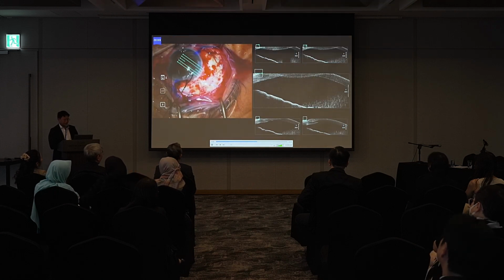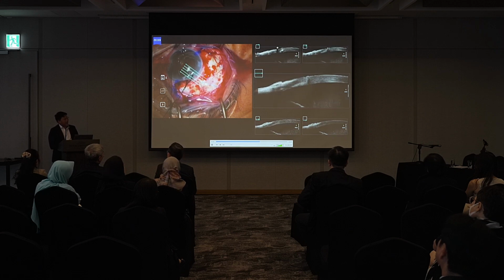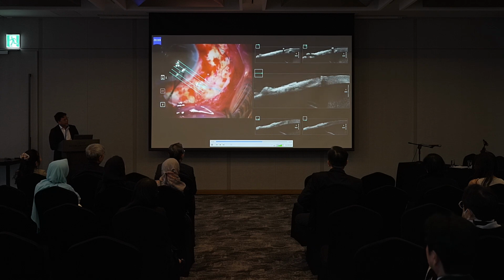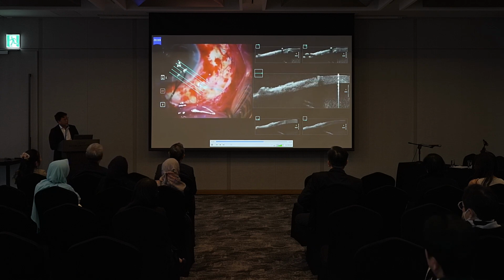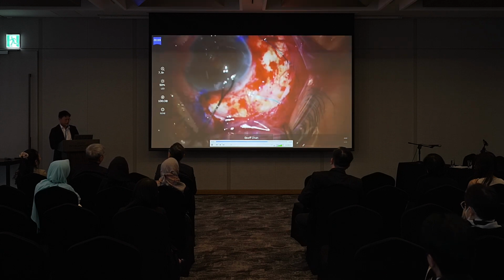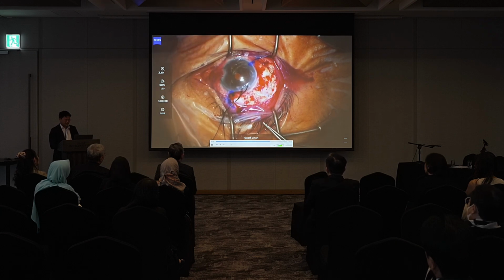And because I like to play around with the intraoperative OCT, because I've got a lot of time on my hands, I like to film over that, and I like to always see how it's running and how the tube's moving through the sclera, and that's the scleral entry, and I'm happy with that in relation to the iris. So basically at this point I'm saying, yep, good job everyone, time to go home, right?